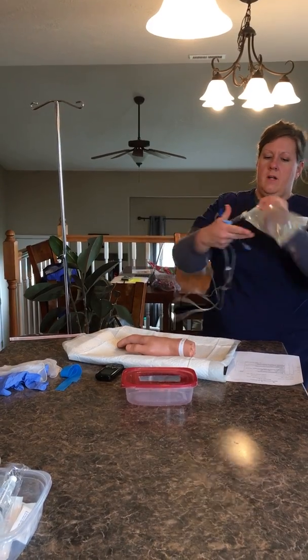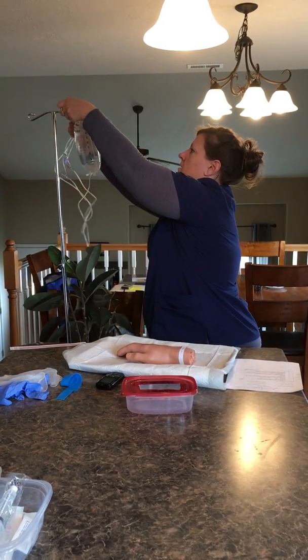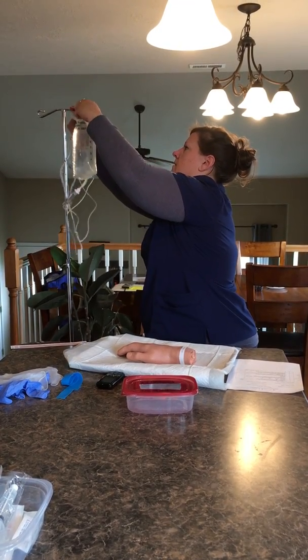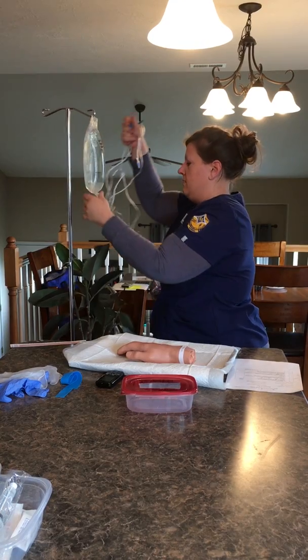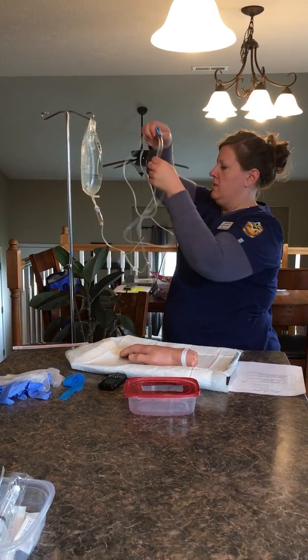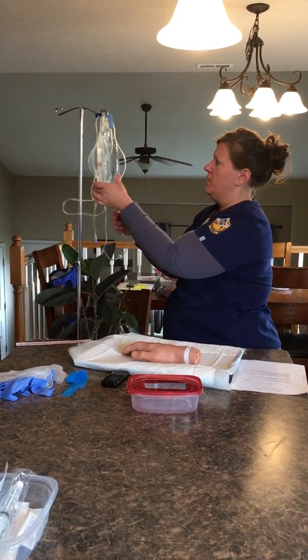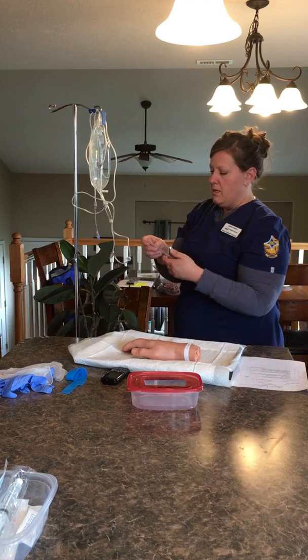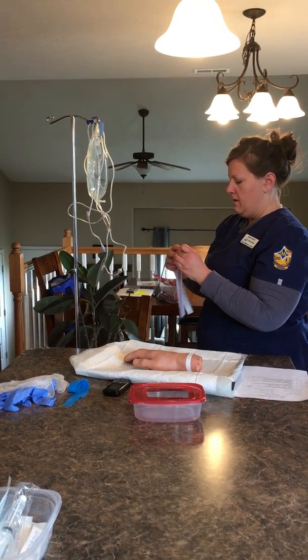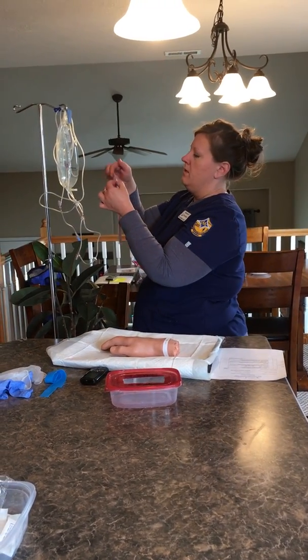All right, once I've got that in there good, we'll go ahead and hang it, again not allowing the end of it to touch the floor. Then I'm going to apply my label, lining up the 0.